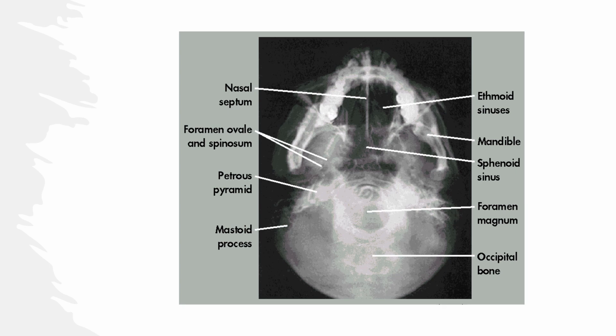And if you follow that backward through the line that says sphenoid sinus, that's actually the TMJ. And then halfway between those two, that's the angle of the mandible. Okay, so that's the key to this radiograph, the gonions, the angles of the mandible.